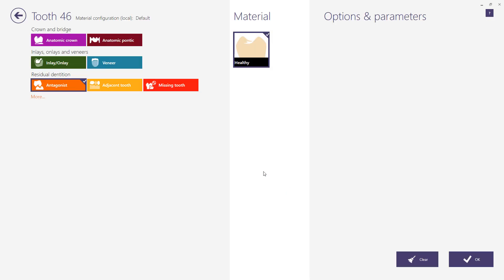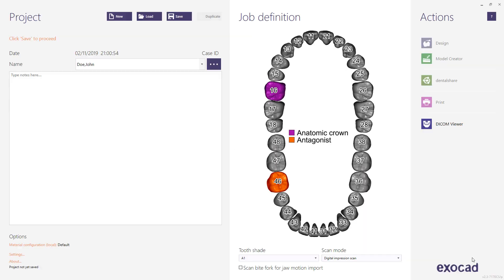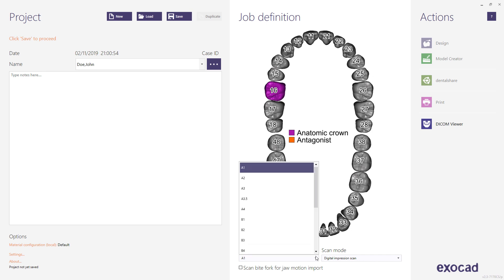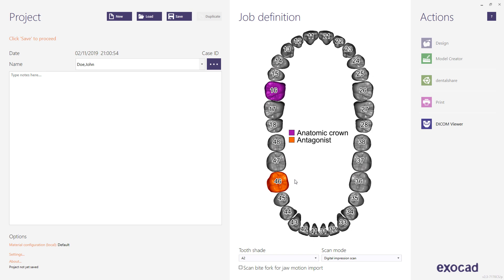The antagonist will be selected automatically depending on the restoration placement. We recommend choosing the tooth shade for your records as an important piece of information for your manufacturing partner. Click the save button to continue.